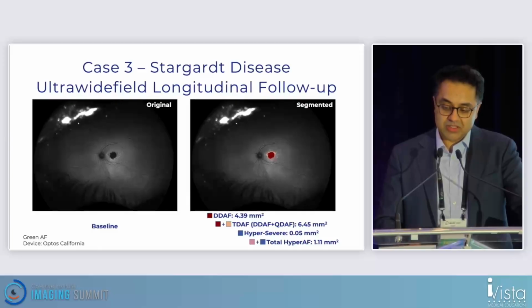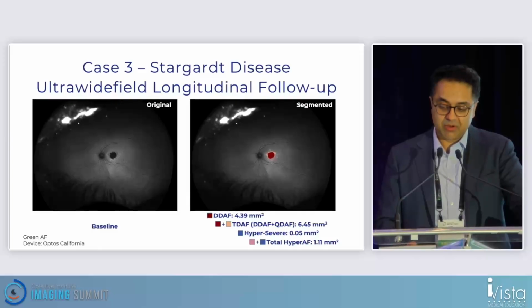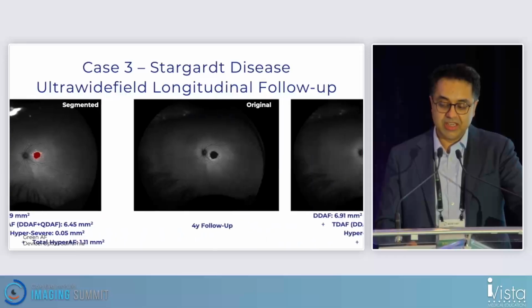This is a patient with Stargardt's disease that's being looked at for longitudinal follow-up and how they're changing over time.